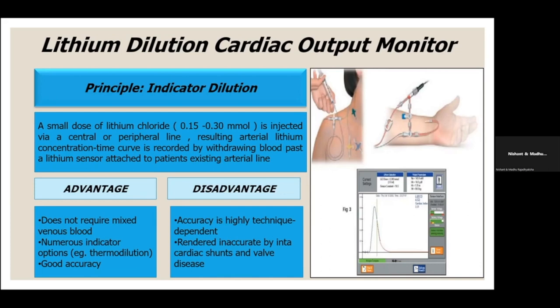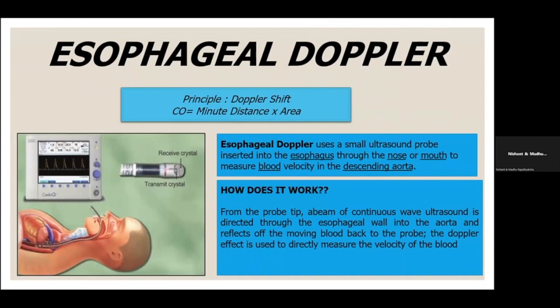This method must be avoided in patients receiving lithium therapy, pregnancy, breastfeeding, and weight less than 40 kg. Next method is a non-invasive method. It is the esophageal Doppler, which is based on the principle of Doppler shift.